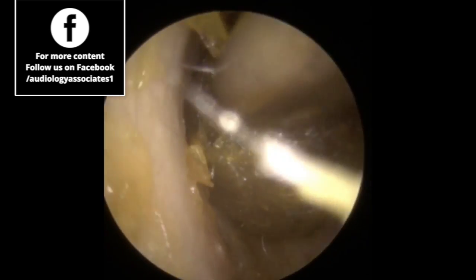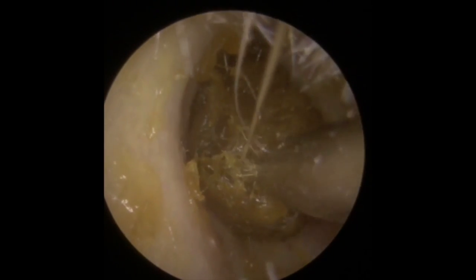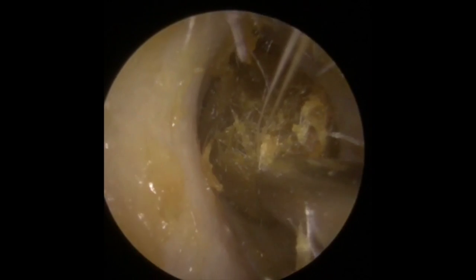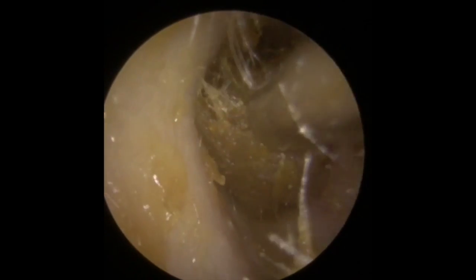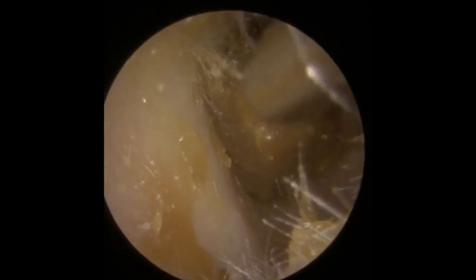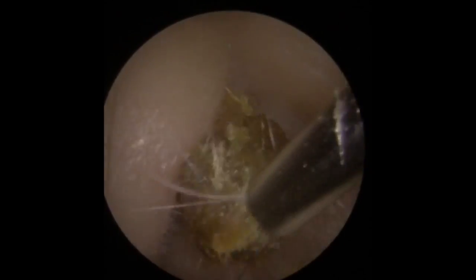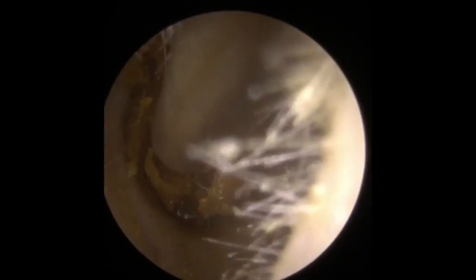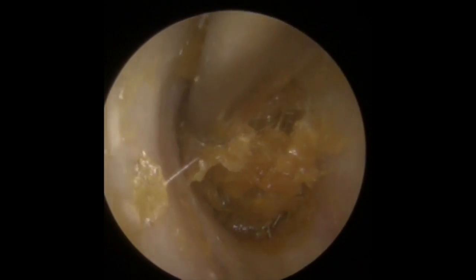This is obviously quite a large chunk of wax in this canal that just broke off halfway down. Working it down the canal, trying to maintain the suction grip on it while we wiggle it up and down. Little pieces breaking away with the suction. That was the rear end of that large chunk of wax, and there's still more — we need to get this piece away as well. This piece is very deep in the ear canal.